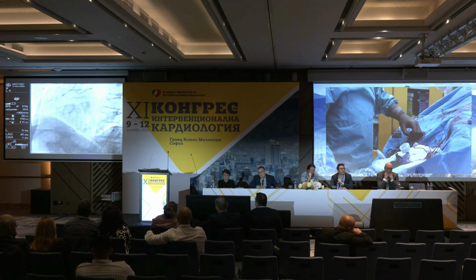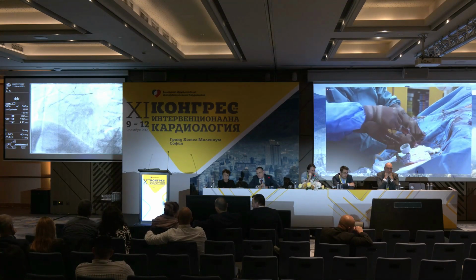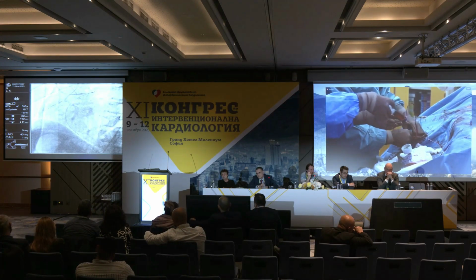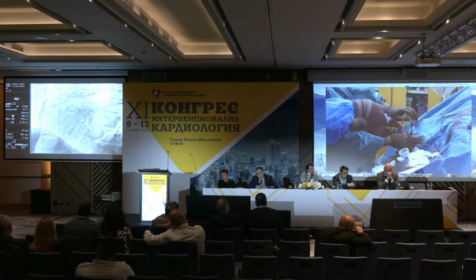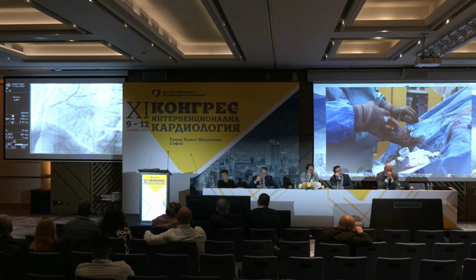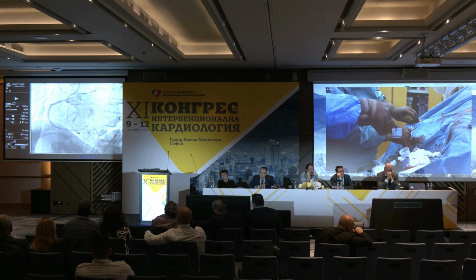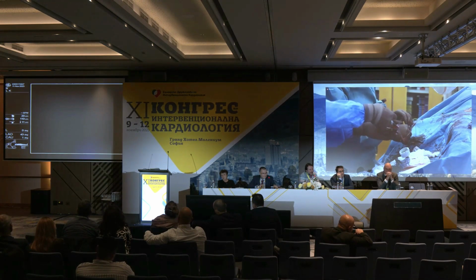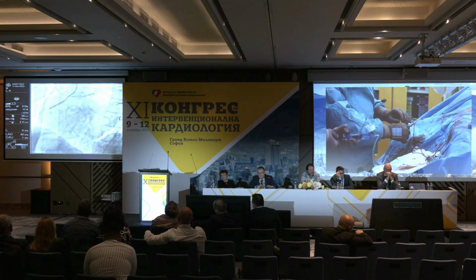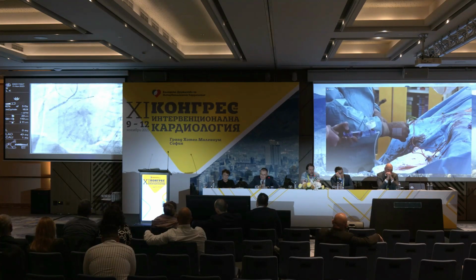I am better now. I will retrieve the guiding catheter a little bit more. Yeah, but there is another trick. You can just inflate the stent with 2 atmospheres and then push the stent so you are exact at the orifice. Yeah, it's a good position too. So it's sometimes very difficult to position the guiding catheter with the stent. So your position was excellent, but it was in the guiding catheter, your stent.